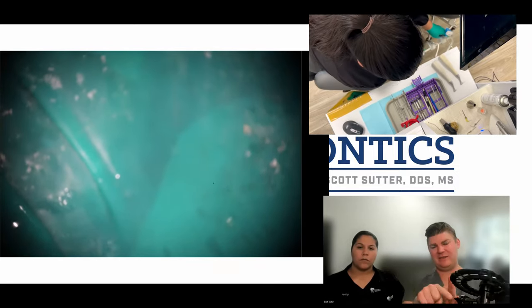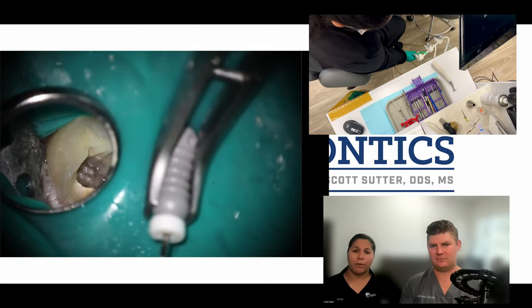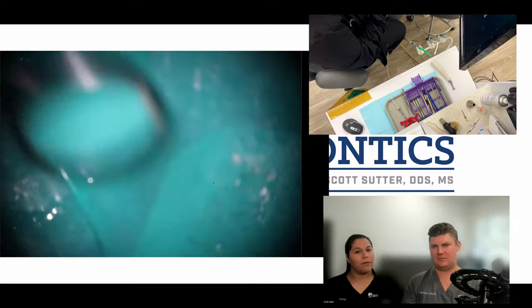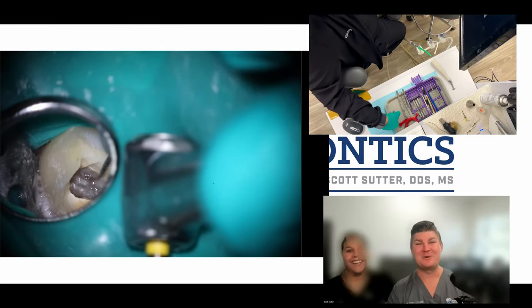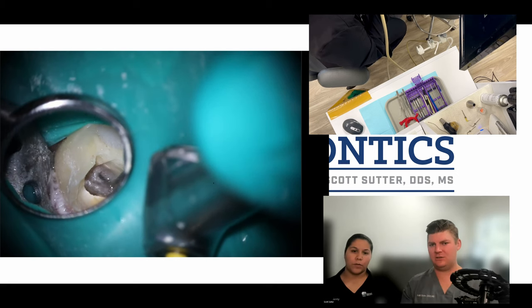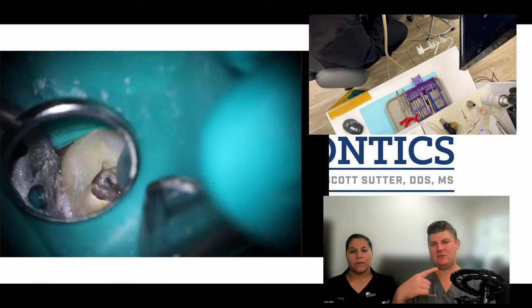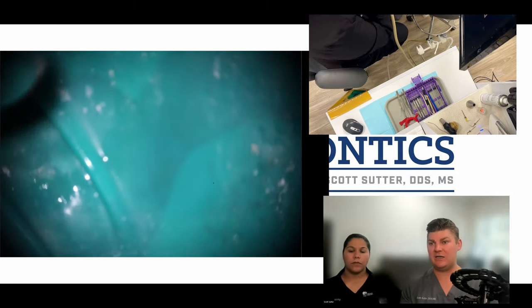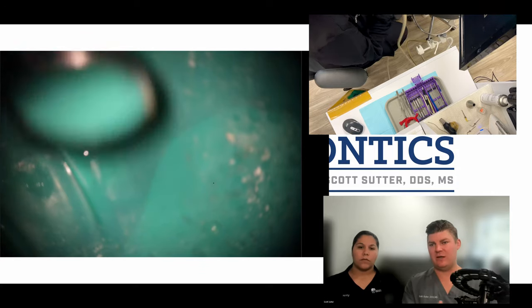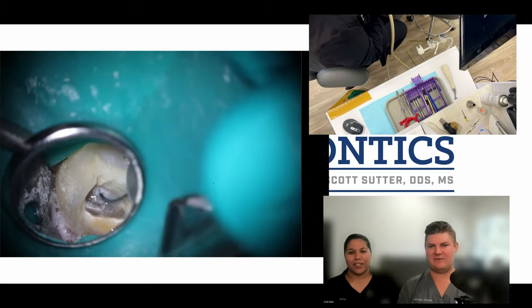Here I'm again grabbing the K file and you saw me automatically pick up the rotary because that's what he's going to need next. Although this time it might be the 17 — actually no, the 20. We tend to talk about the weather, sports, whatever book she's reading, recent movies when working, but I'm always calling out if we switch things up from the ordinary. At this point I knew I was going to need the 17 after because the 20 didn't drop down to even close to my estimated working length. She has octopus hands — she can hold like 20 things in her left hand. Going down now with the 17 and you'll see it drop right there — now I know we're looking good.